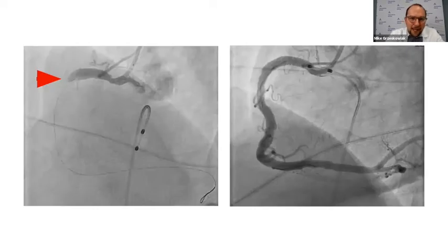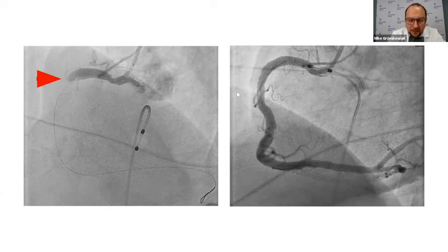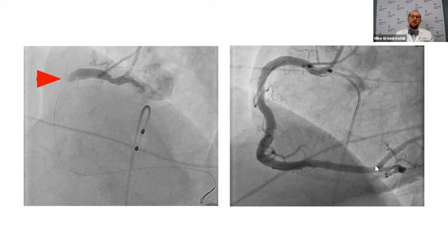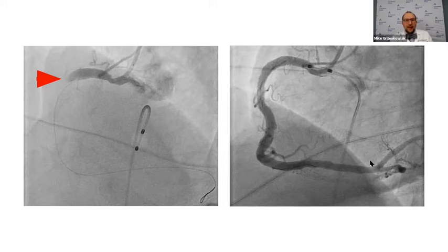This is the right coronary artery. There's 100% occlusion of the proximal RCA — that's why he was hypotensive. This is a big vessel. We pushed a wire and actually had to place a lot of stent in this coronary because he had a lot of clot and disease. Once we opened it up, you can see how big and beefy this vessel is — it's supplying a big chunk of his heart. The RCA supplies the SA node with one of its branches, and it supplies the AV node with a posterior lateral branch. That's why this patient was going into second-degree type one heart block from 100% occlusion of this big vessel.